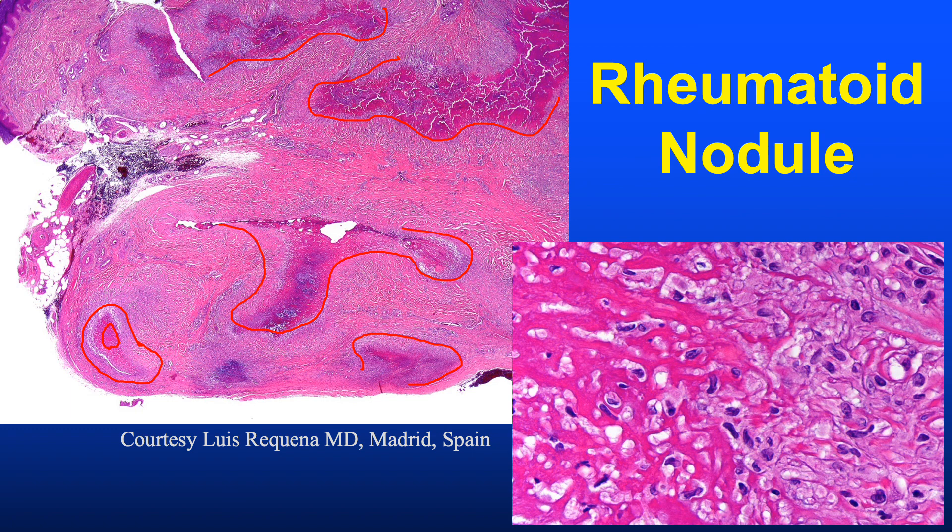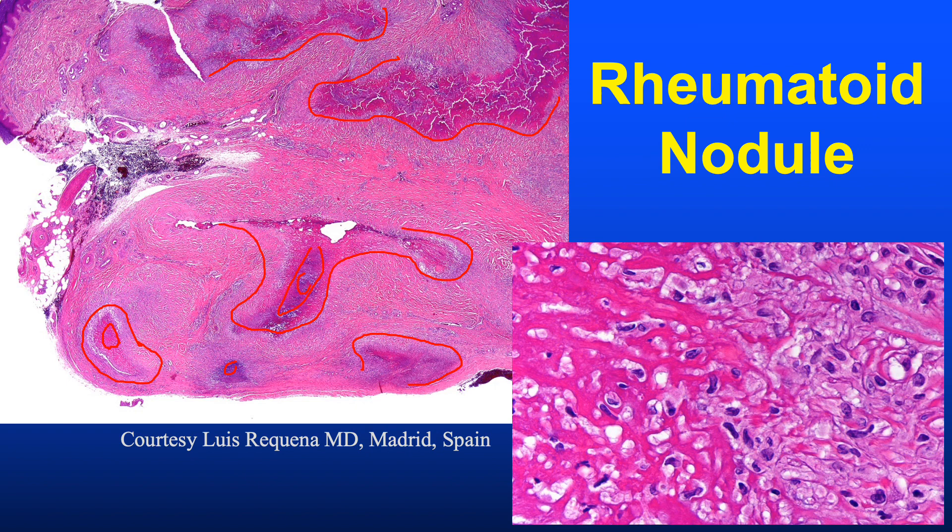Rheumatoid nodule is the last of the palisaded granulomatous reactions we'll discuss today. It typically occurs as deep, often subcutaneous granulomas involving the elbow or finger joints in patients with established rheumatoid arthritis. At low magnification we see large, irregular, palisaded granulomas with fairly bright pink material in the center of the palisades — consistent with fibrin, a hallmark of the rheumatoid nodule. Fibrin has a more homogeneous, liquefied, amorphous appearance compared to necrobiotic collagen, which retains some fibrillary quality. Rheumatoid nodules are characterized by fairly well-organized, large, coalescent palisades of histiocytes, with bright eosinophilic fibrin in the centers — and some variable basophilia from mucin or cellular debris.